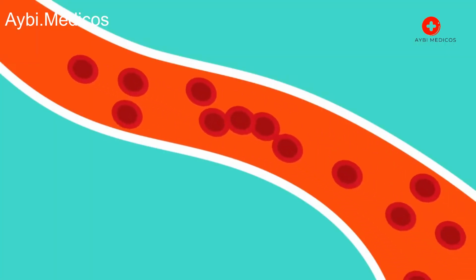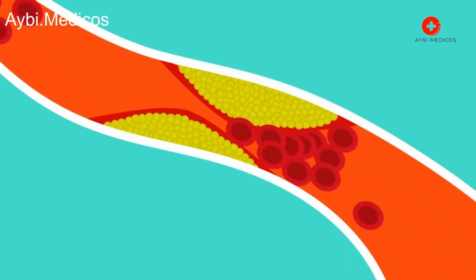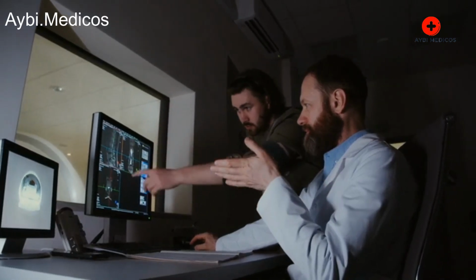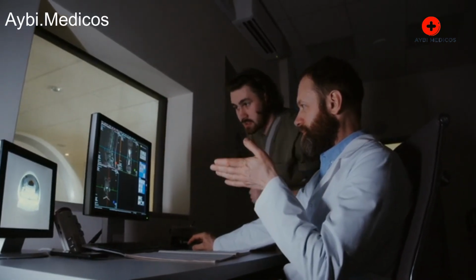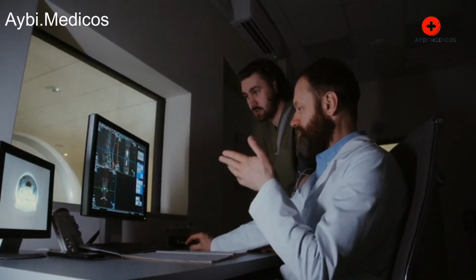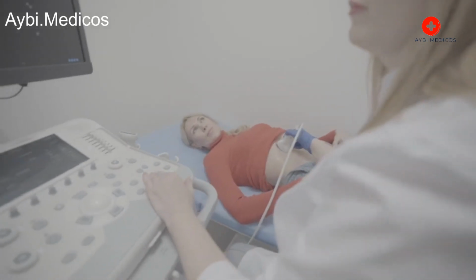Vascular imaging. Doppler ultrasound can assess blood flow and detect issues like blood clots, narrowing of blood vessels (stenosis), and aneurysms. Guidance for procedures. Ultrasound is used to guide minimally invasive procedures like biopsies, drainages, and injections, ensuring accuracy and reducing risks.